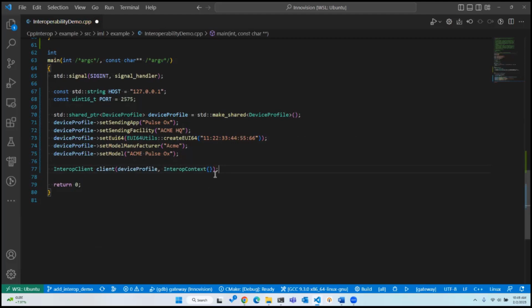The interop context is used for more advanced topics like customization or extensibility. So I'll just go over a few of the options that are available there, but we won't get into that in today's demo.